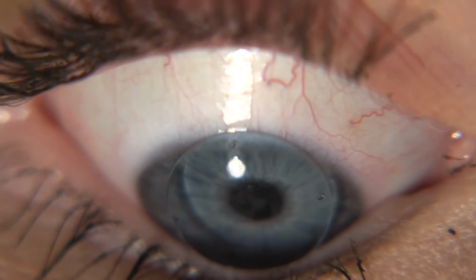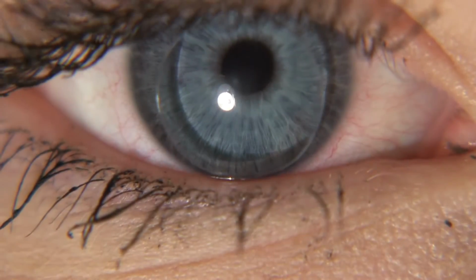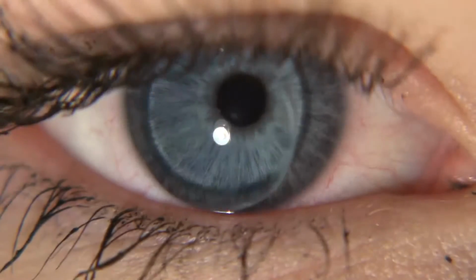While evaluating the lens on the eye, have the patient look down and then lift their upper eyelid. You should see the lens edge approach the upper limbus. This lets you know that the lens is translating and the patient will achieve the desired near vision.